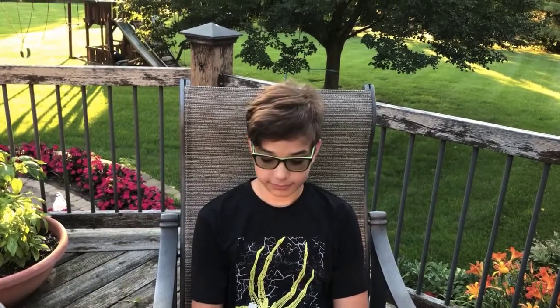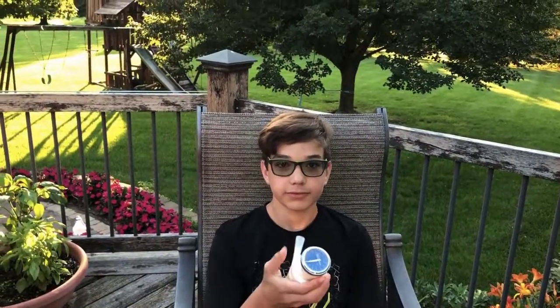Do you understand what I mean by that? So what we're gonna do is I'm gonna have you do tidal breathing for just a few breaths, and then you're gonna put the spirometer up to your lips, that plasticky part, and blow as hard as you can all the way out. In order to really get a good reading, sometimes you actually have to bend over and compress your abdominals to really force that diaphragm up, squish the lungs, increase the pressure in there and cause the air to come out. We're gonna do that three times. Each time you do it, I'm gonna take a picture of where the measurement gets to, then we'll reset it and you'll do it again.